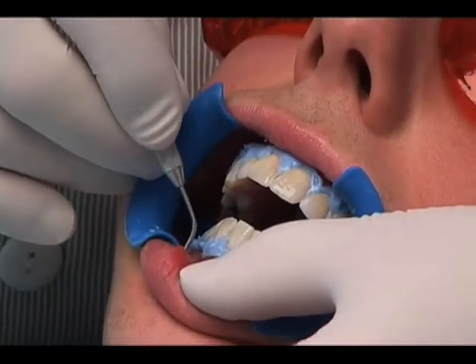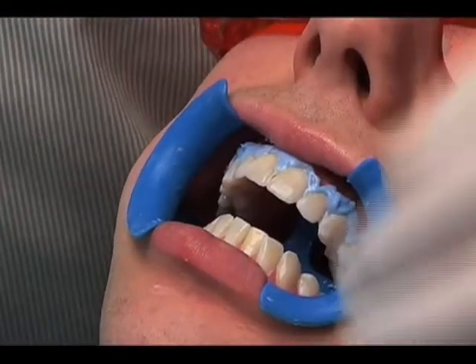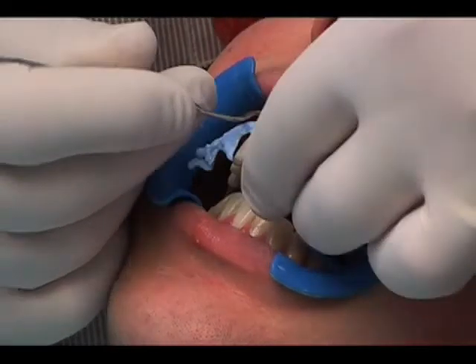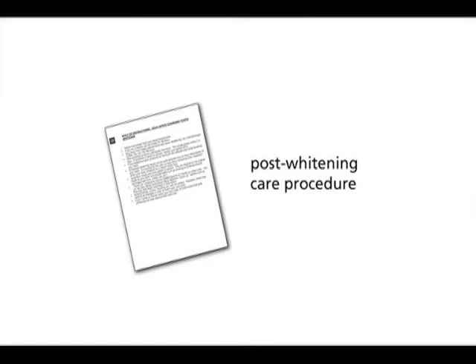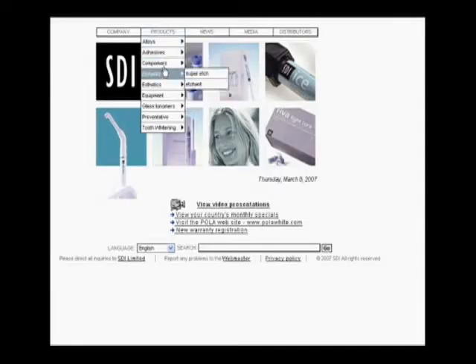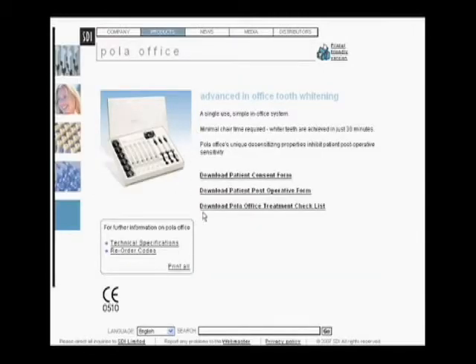Remove the gingival barrier by lifting it from one end using an explorer or other instrument. We recommend at this stage an after photo be taken. Discuss the outcome with the patient and the recommended next steps. It is important that you discuss with your patient the post-whitening care procedure, which can be found on the SDI website www.sdi.com.au under the tooth whitening Pola Office tab in the products menu. You may choose to dispense a desensitizing gel such as Soothe to minimize any post-whitening sensitivity.